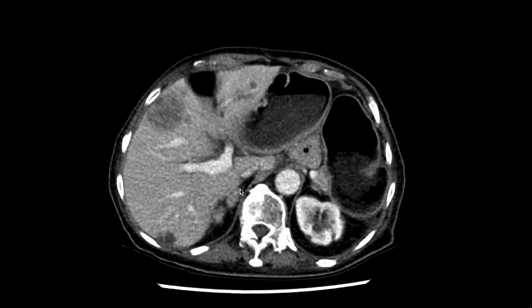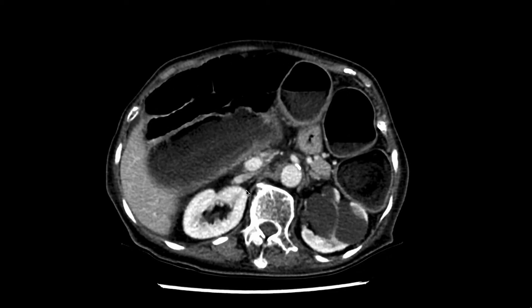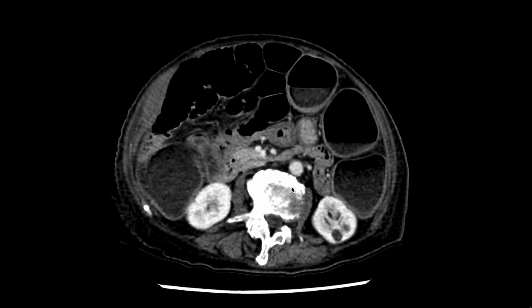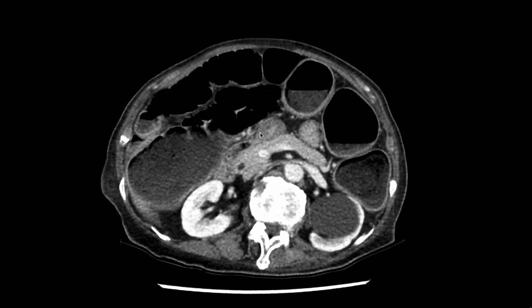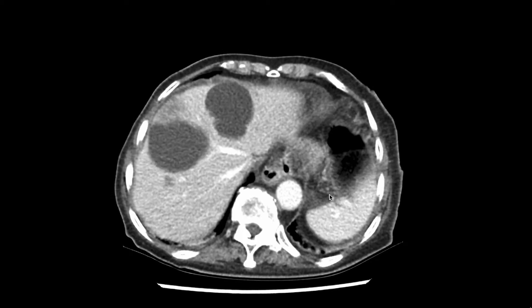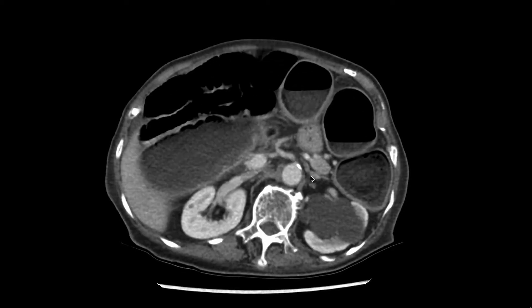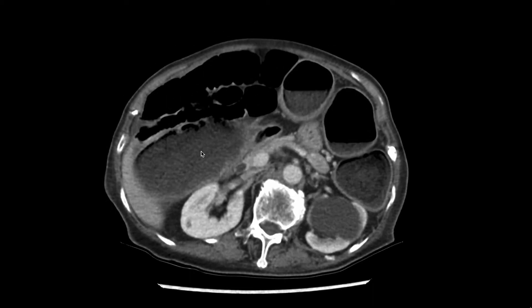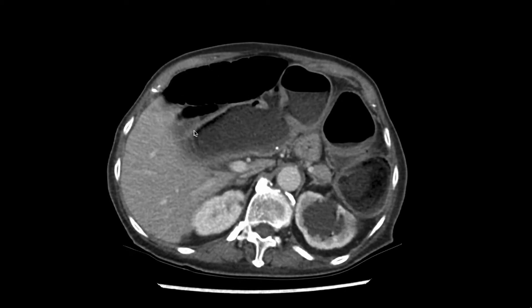Furthermore, we see a lobulated ovoid soft tissue density lesion which is inseparable from the medial limb of the right adrenal gland. In this context, this is suspicious for an adrenal metastasis. We don't see any other metastases within the abdomen — the spleen, the left adrenal, the kidneys, the pancreas, and the gallbladder are all normal and apparent.